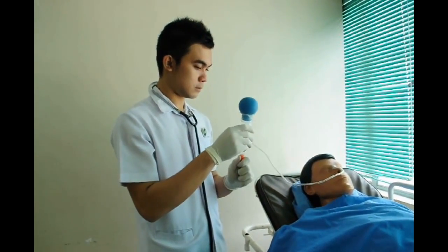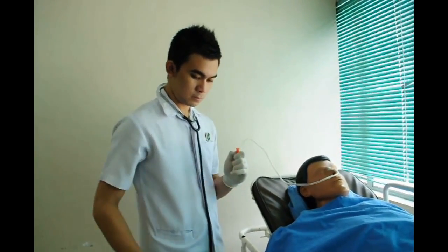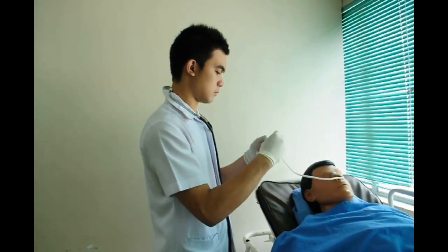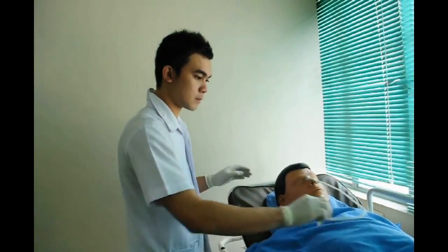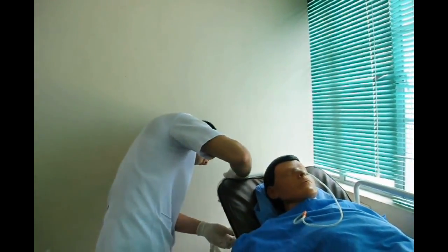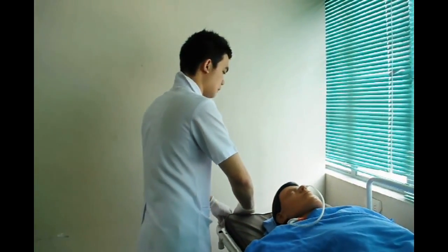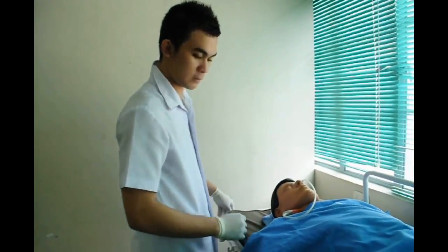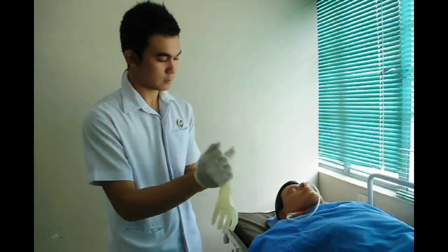After this step, kink the tube and pin it back on the patient's gown. Remove all equipment, lower the bed, and make the patient comfortable. Remove non-sterile gloves, perform hand hygiene, and document the procedure done. This hand hygiene deters spread of microorganisms, and patients should be given utmost comfort.